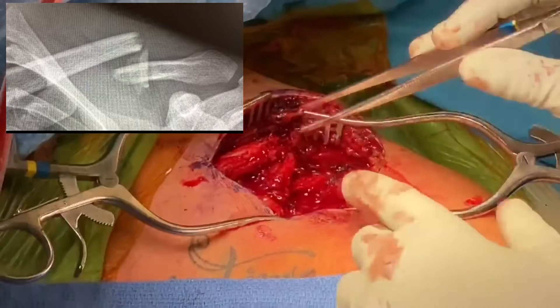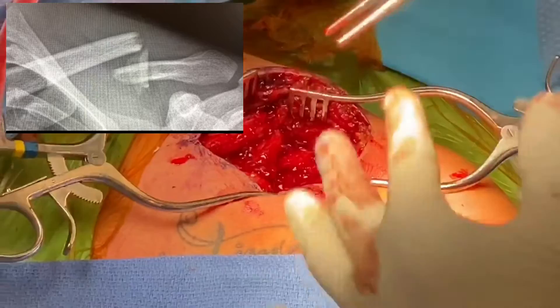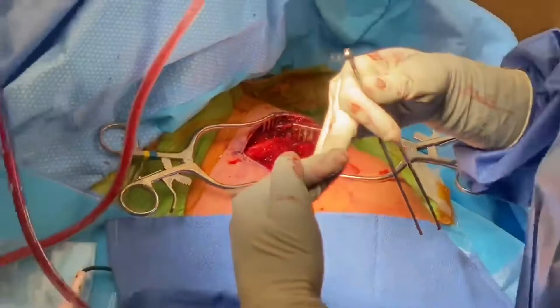So the next portion — I'm going to have to fix this butterfly to either the medial side or the lateral side, and make it basically instead of three pieces into two pieces, and then we'll fix those two pieces back to one.